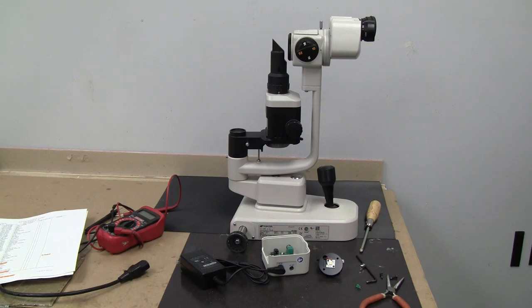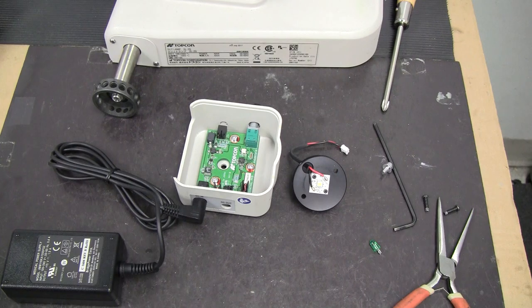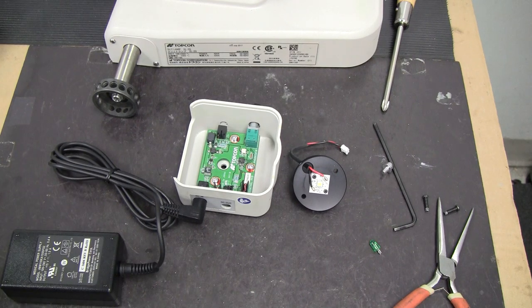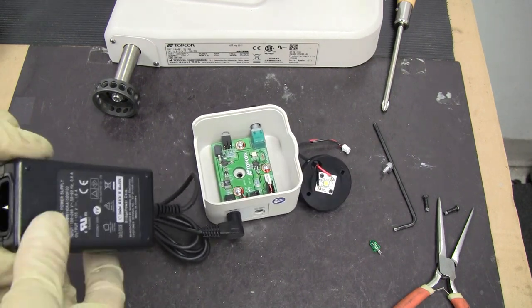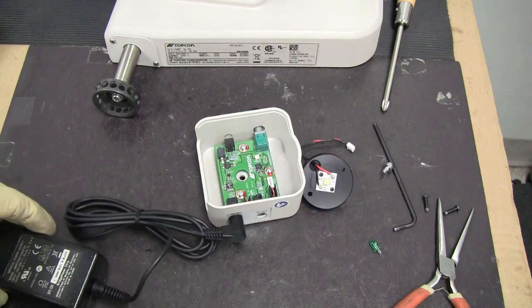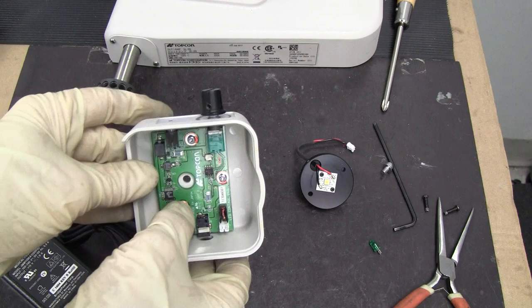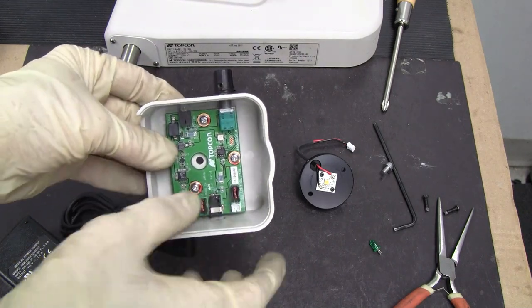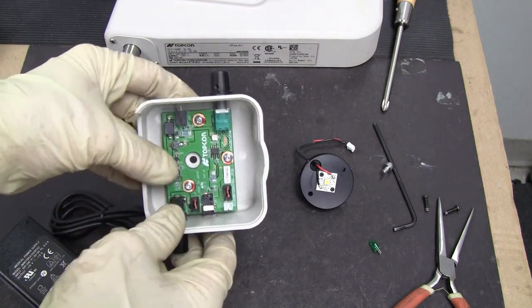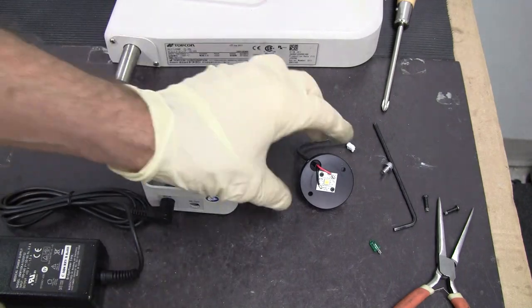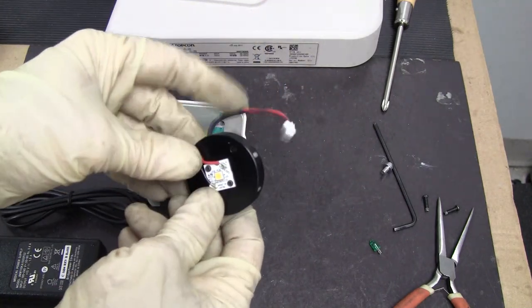This is a Topcon SL2G slit lamp. The main electrical components are the power supply, the LED control PCB, and the LED unit.